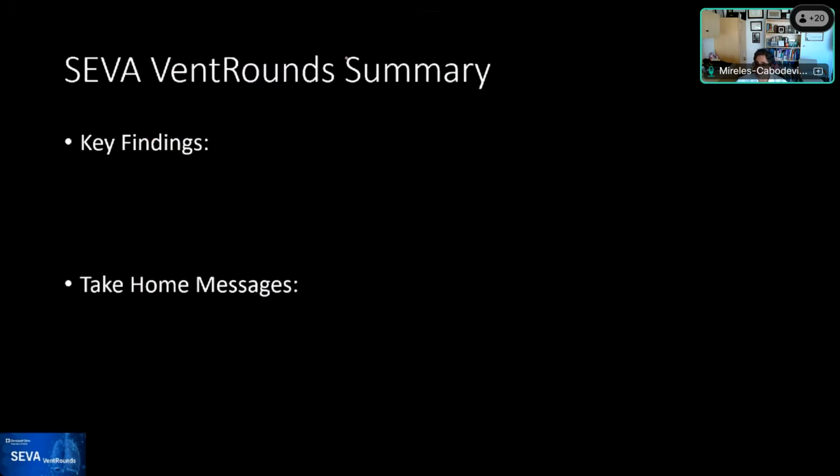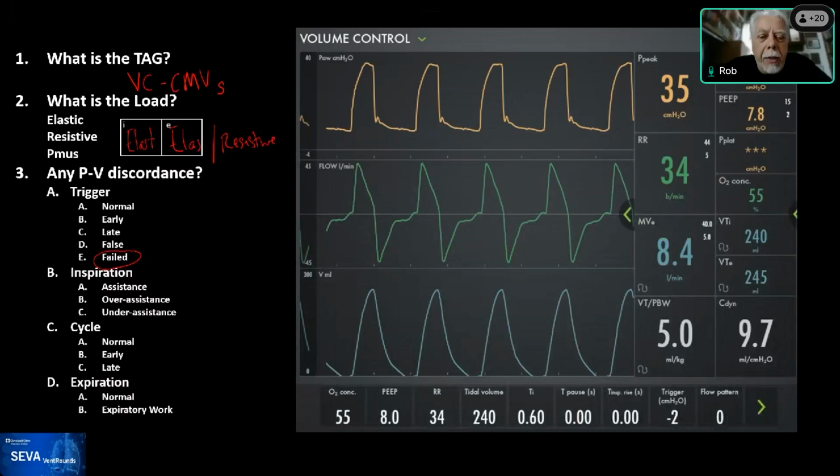So Eduardo, real quick question. That the patient's trigger effort rate is the same as the set rate of the ventilator, for what we can see. You think that's some kind of entrainment happening? Oh yeah. That the patient's just not able to do it? Absolutely. I think that's what we were talking about in the instructor class, and in a way, I mean, it's going at the same rate. So is this because we set the ventilator so well, or is this an entrainment process that occurred? And so, yeah, absolutely, Ariel.